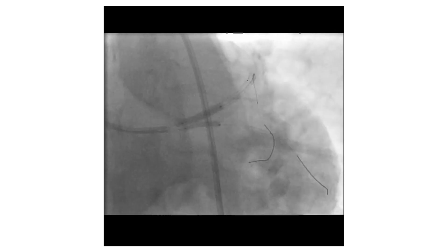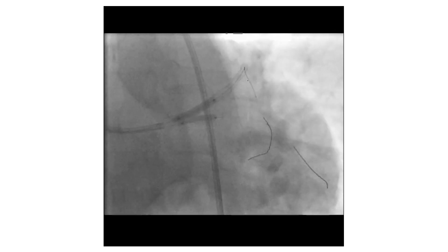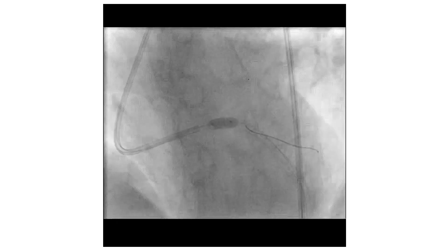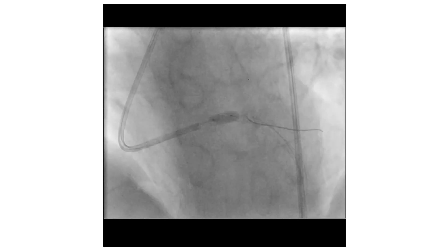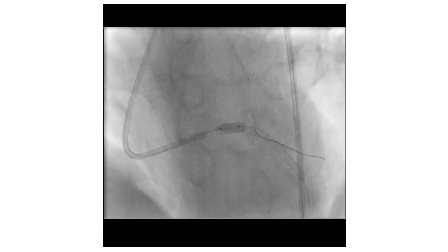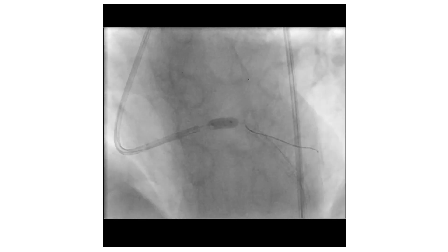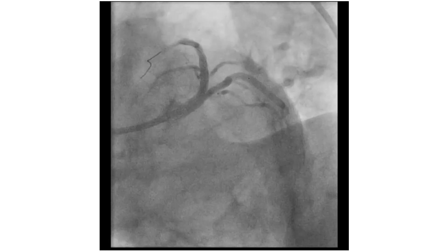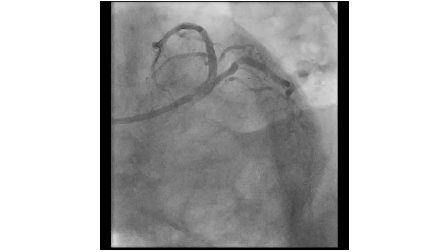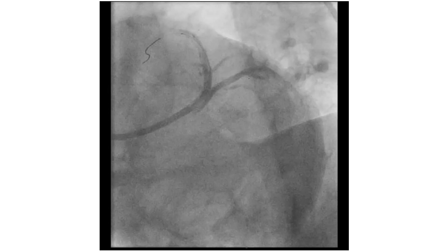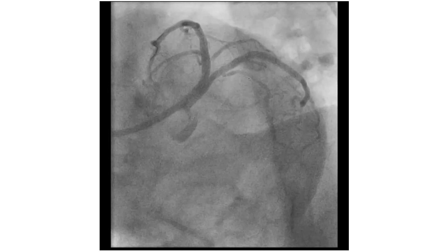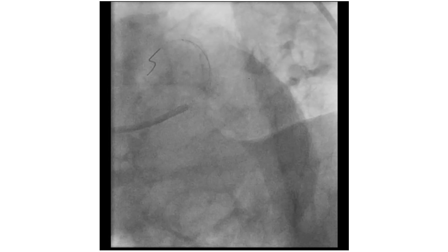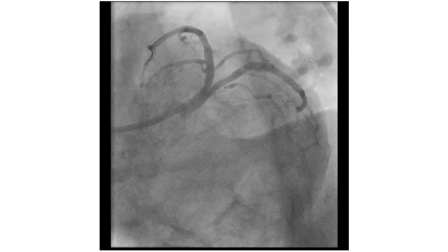Kissing balloon inflation was done in both vessels. Final POT again with a non-compliant balloon was performed. This is the final result — there was no need to put a stent in the side branch.